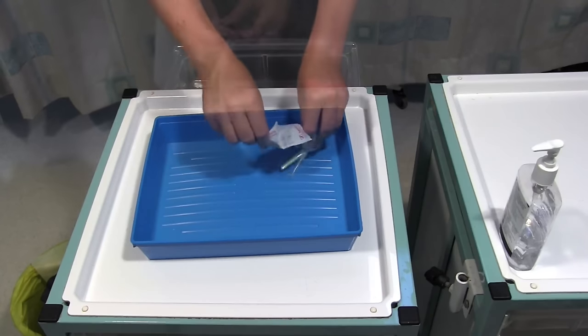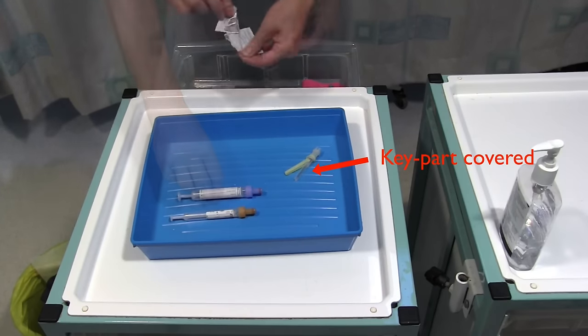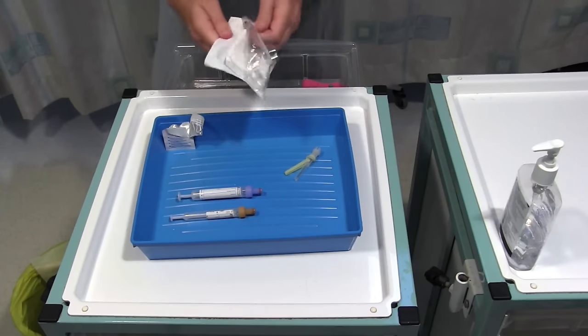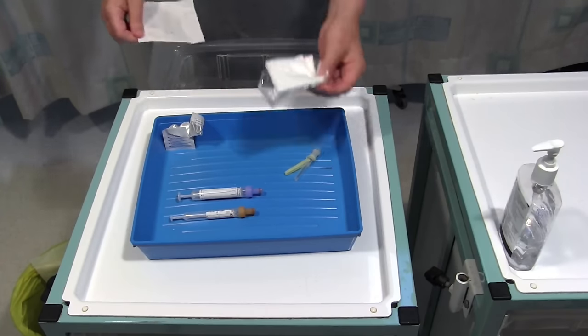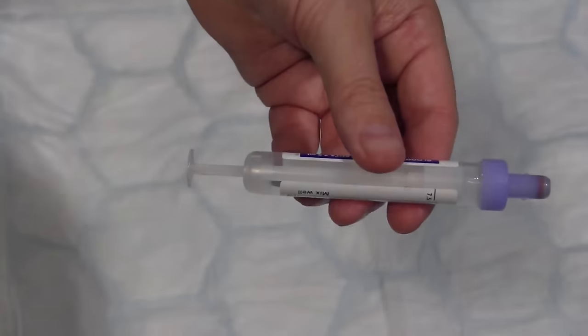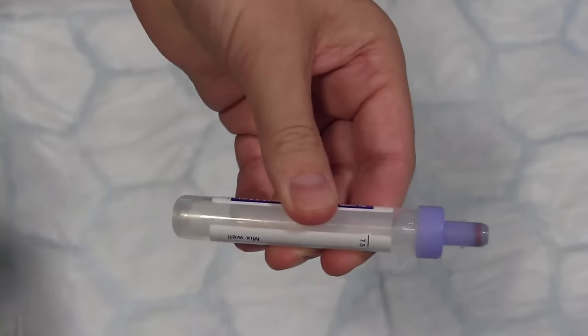Open the equipment into the tray taking care to ensure that any key parts do not get contaminated. Pre-vacuum your sample bottles by pulling back on the plunger until it clicks and then breaking the end off.